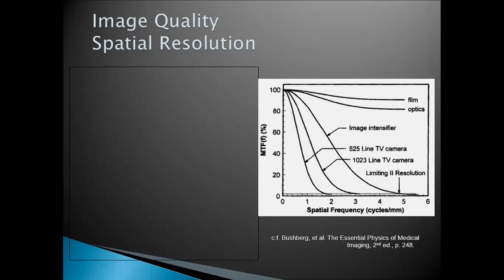This is 1023, 1023. This is the image intensifier. This is optics.